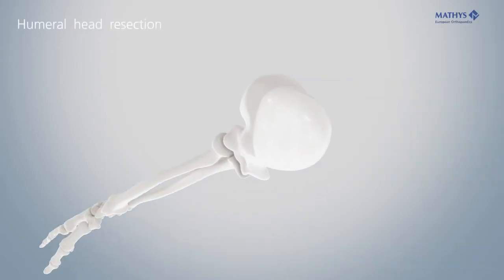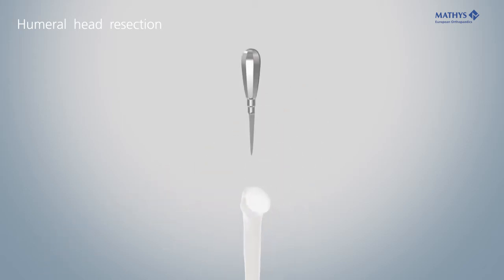Open the medullary cavity at the highest point of the humeral head with the awl, centered and parallel to the stem axis. Ream open the medullary space and leave the guide rod in place.